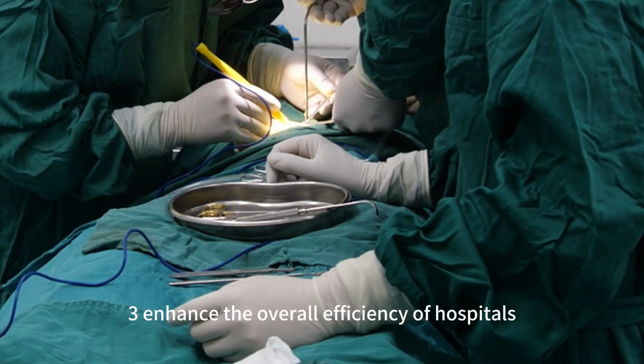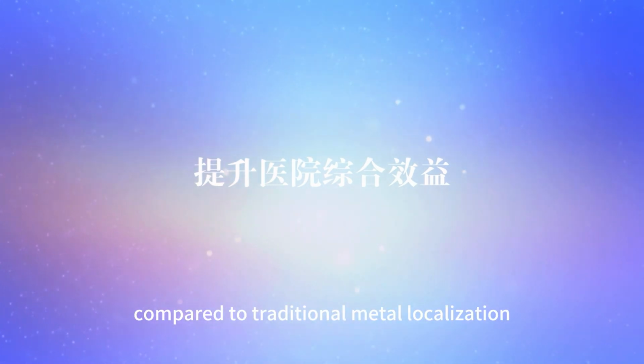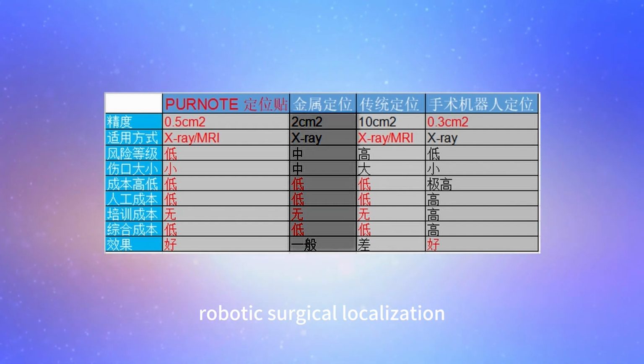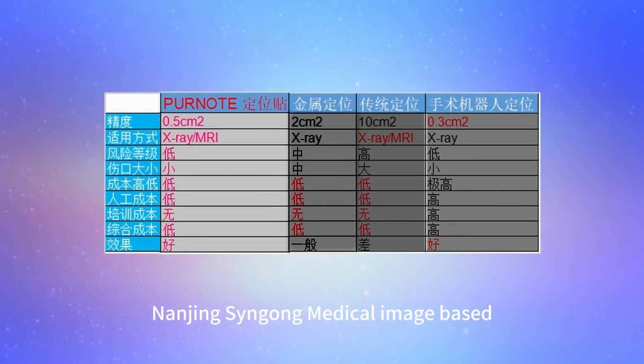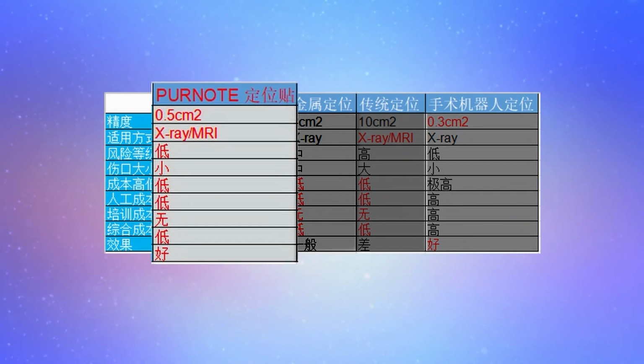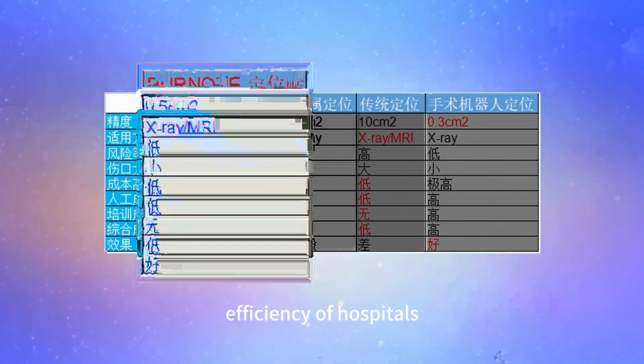3. Enhance the overall efficiency of hospitals. Compared to traditional metal localization and robotic surgical localization, Nanjing Sengong medical image-based external positioning adhesive stands out in improving the overall efficiency of hospitals.